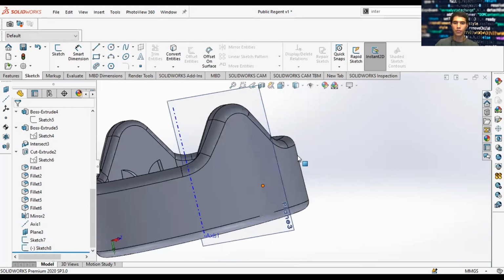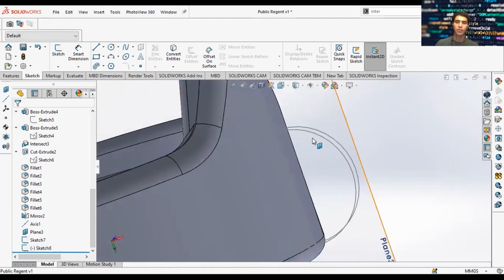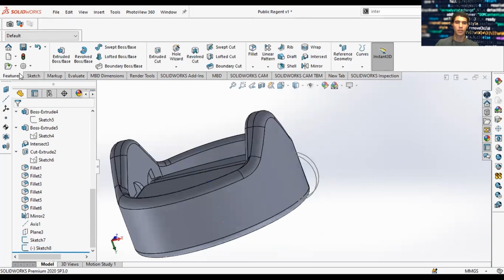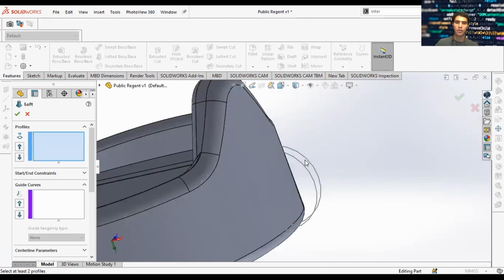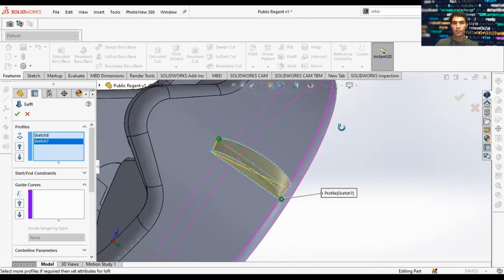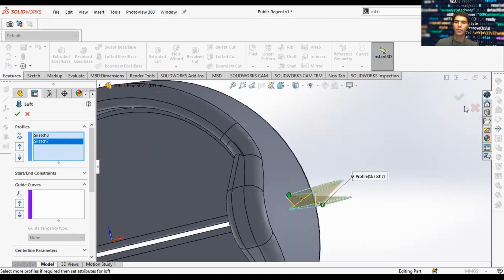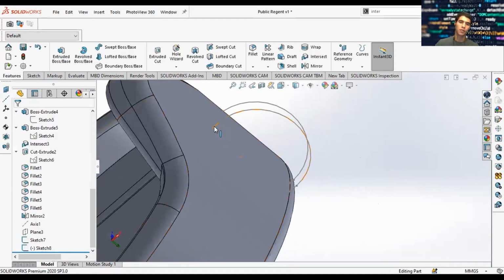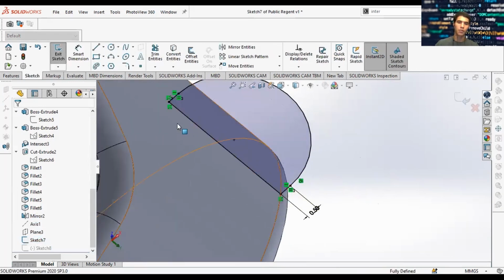So what do you have now? You have two arcs, or semi-lunar shapes, half moon, and let's do a loft. The loft is going to connect these shapes together. And go to this one. So now I want to check when you do a loft for certain things. First of all, your sketch has the same number of connectors. So for example, if you do a triangle, you have 3 connectors, correct? So just three sides. And in this case, it would be an arc with 2 dots and a line, so 4 connectors. You might want to check your sketch to make sure that connectors are the same before you do a loft. So here we have 1, 2, 3, 4 connectors.